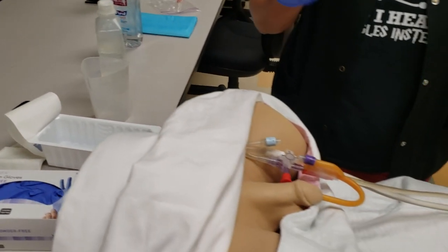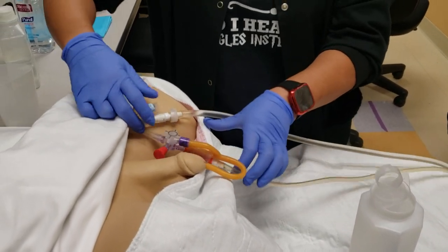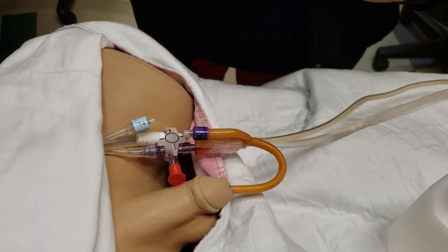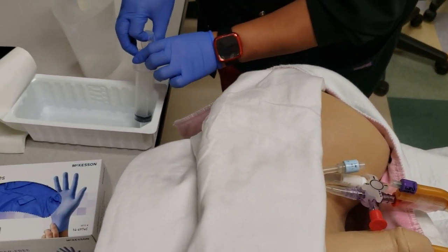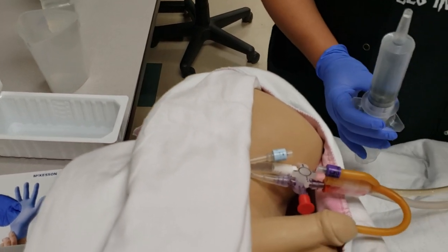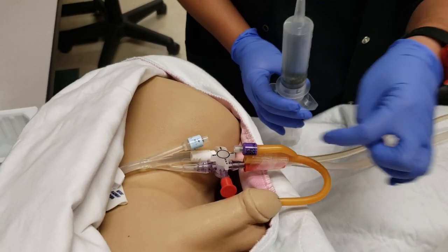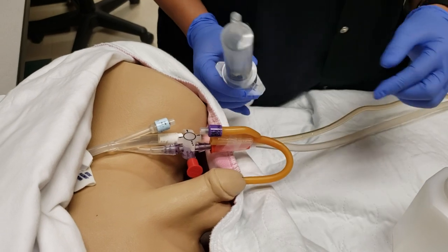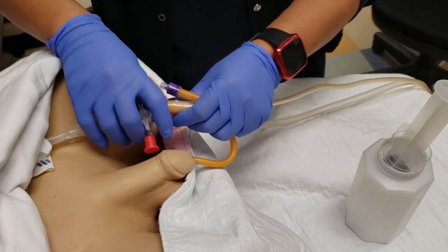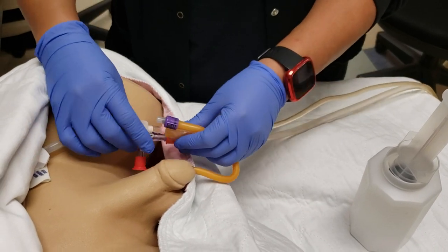Find the port that connects to the patient. Draw up sterile saline into your syringe. At this point, be very careful because the patient's bladder may be very full. If nothing is coming out, we need to open up any blockages. Go ahead and disconnect the port going to the patient.